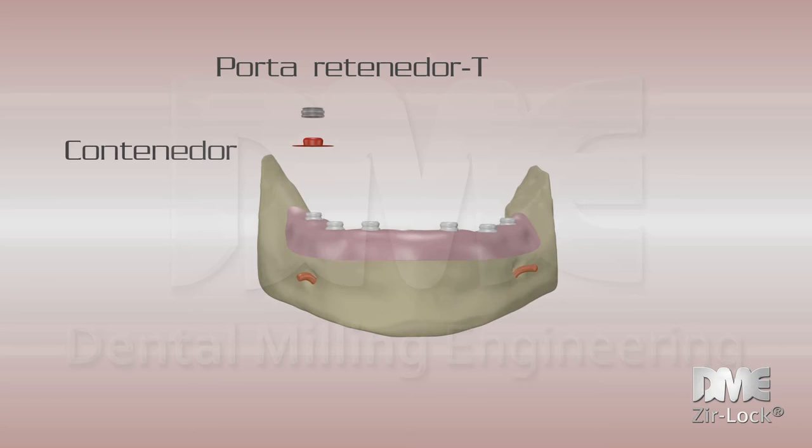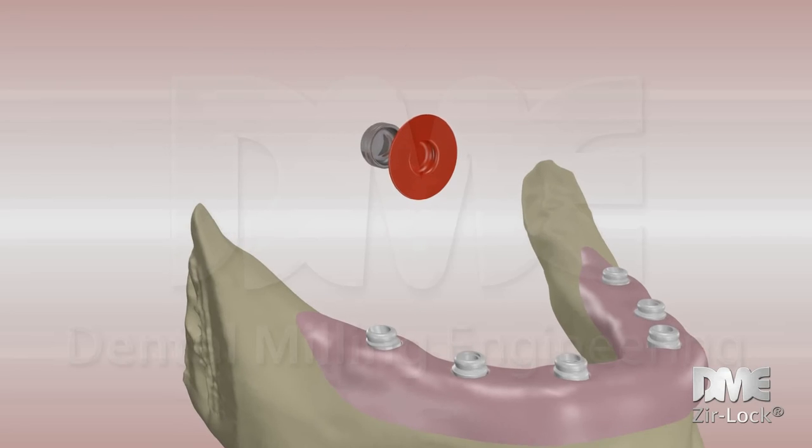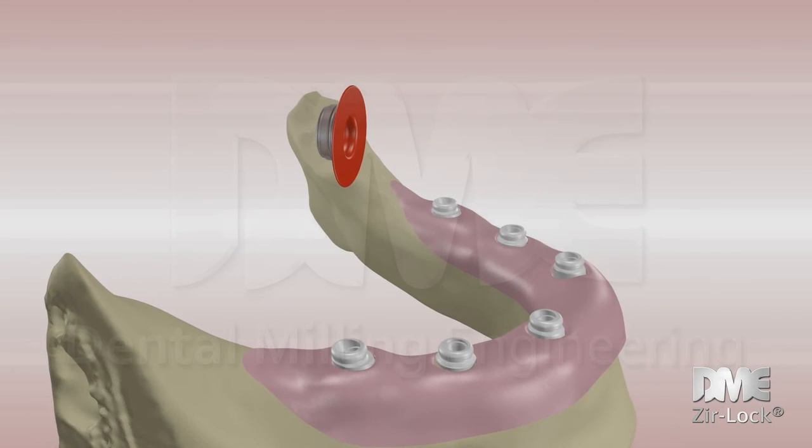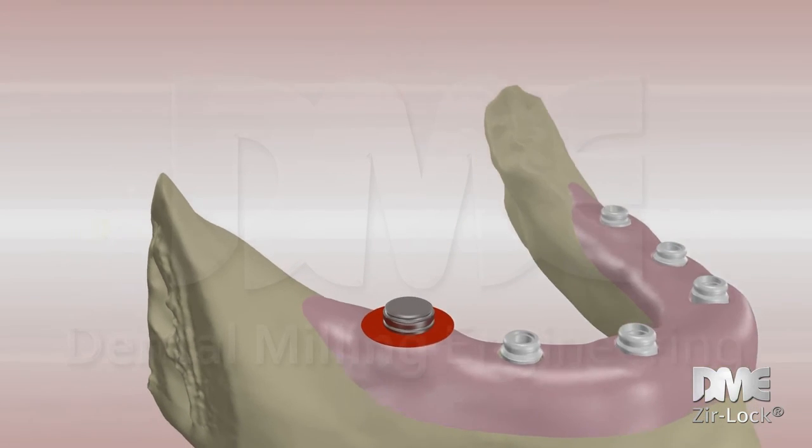In this step, it is prepared to cement the retainer holders to the prosthesis. We recommend using cement with fixing characteristics, allowing metal to metal. The Zir-Lock container is the attachment that will help us cement titanium retainer holders. It is specially designed to prevent cement seeping between the gum and the male. That is, it prevents cement from males impeding the removal of the prosthesis once cemented.